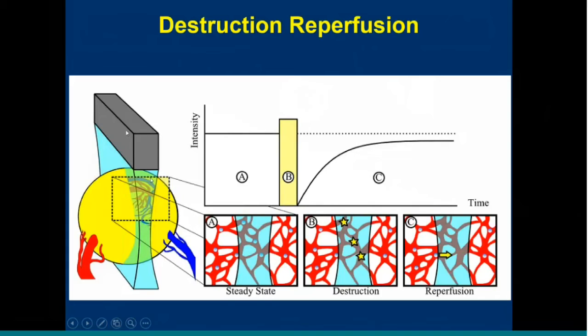We gather one imaging plane at about the center of the tumor, wait for it to hit a steady state, and then move the transducer to about the three quarters. So it's a parallel plane, but it's a little bit to the side. Get a second cine-loop, and then move it back, still parallel, to the one quarter here, get that, and then move the transducer so it's perpendicular and get a final destruction cine-loop.